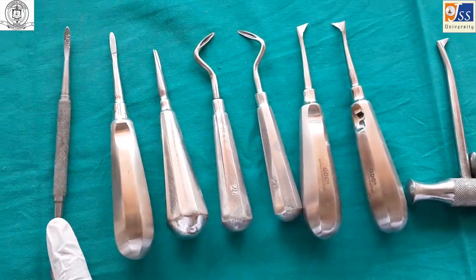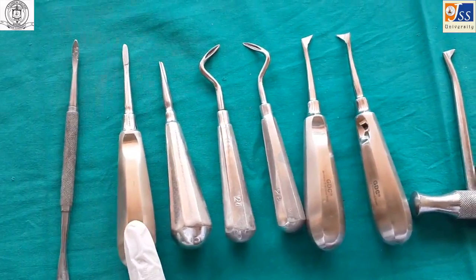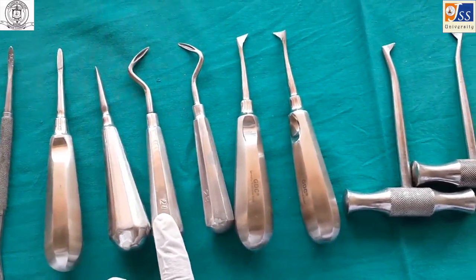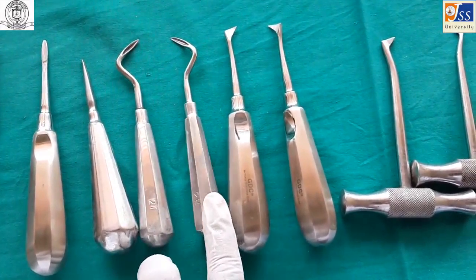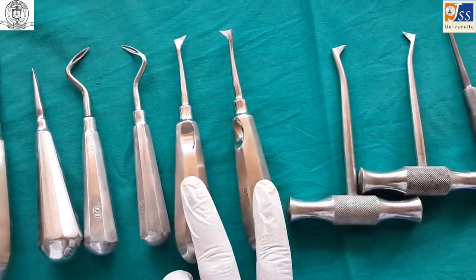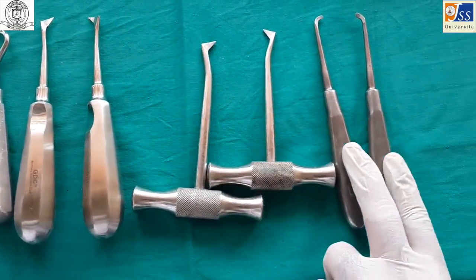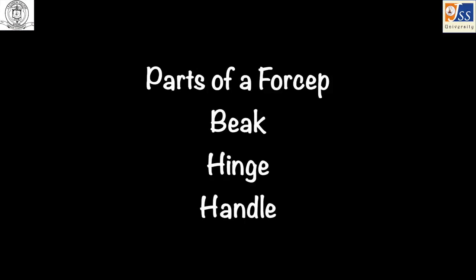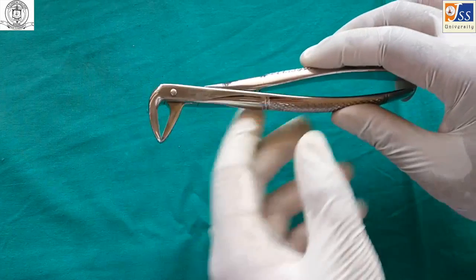Elevators revision: periosteal elevator, straight elevator, Coupland's elevator, Apexo elevator, Cryer's elevator, crossbar elevator, and Warwick James elevator. An extraction forceps consists of three parts: beak, hinge, and handle.